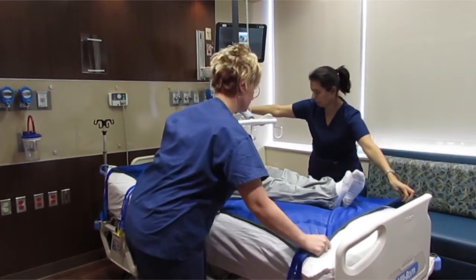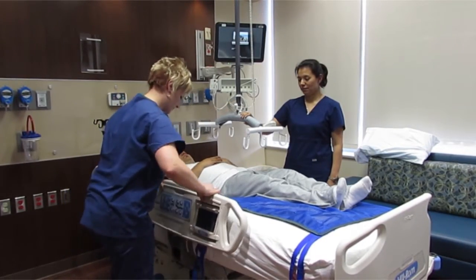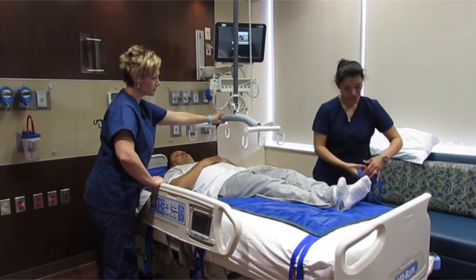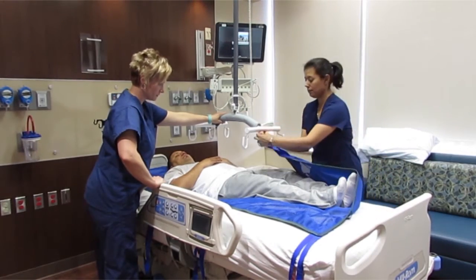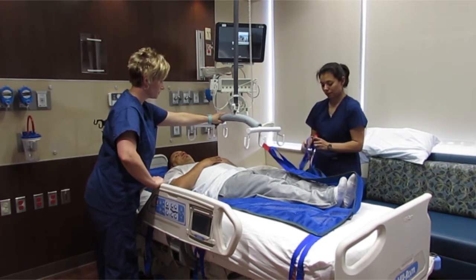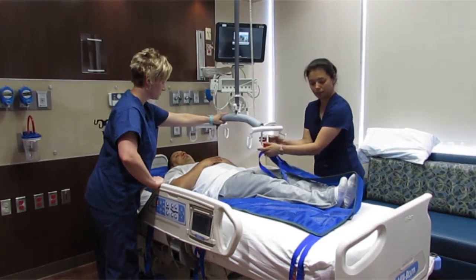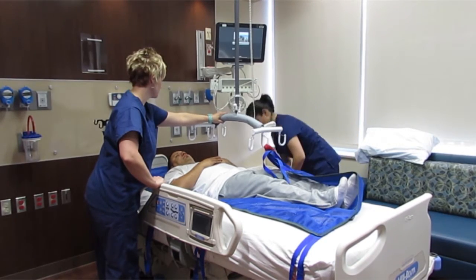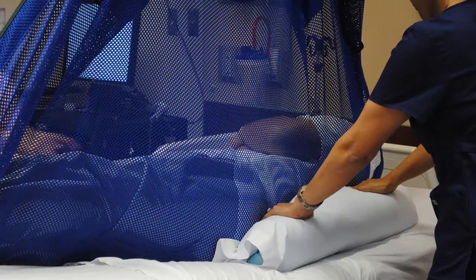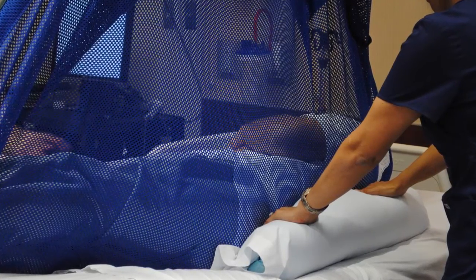To offload the patient to one side by log rolling, first be sure that the bed rail is up on the side the patient is rolling towards. Then hook up the sling by using only the red loops of the other side. Be sure to hook the red loops to the middle hook of the spreader bar to keep the bar balanced. Raise the patient up enough to tuck a pillow or wedge behind the patient to keep the patient in side lying.